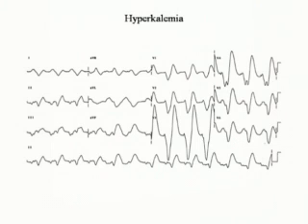So this is severe hyperkalemia. We're talking between 9 and 11, potentially near fatal hyperkalemia. So it starts with the T-wave abnormality, but the T-wave abnormality is less prominent as hyperkalemia becomes more severe. So I think that's the high points for EKG.